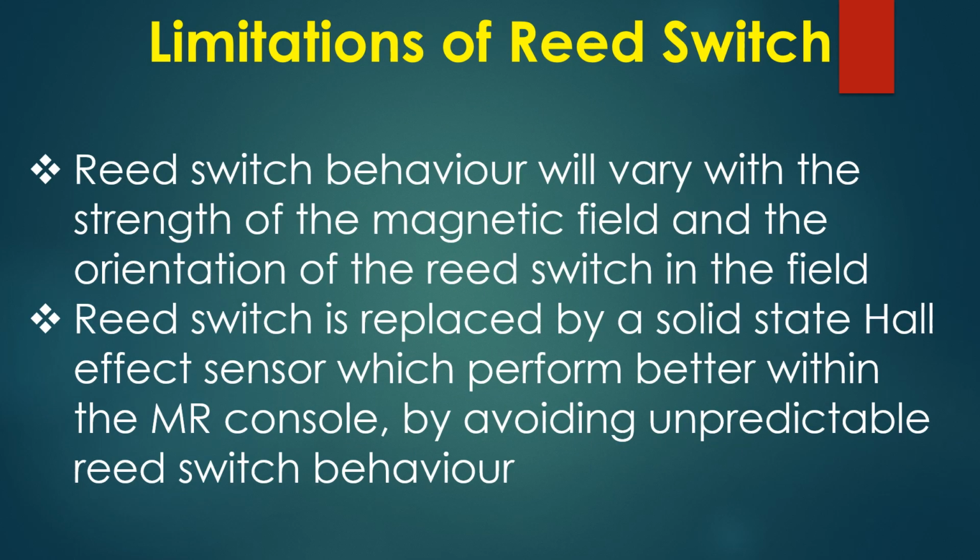Reed switch behavior will vary with the strength of the magnetic field and the orientation of the reed switch in the field. The reed switch is replaced by a solid state Hall effect sensor, which performs better within the MR console by avoiding unpredictable reed switch behavior.